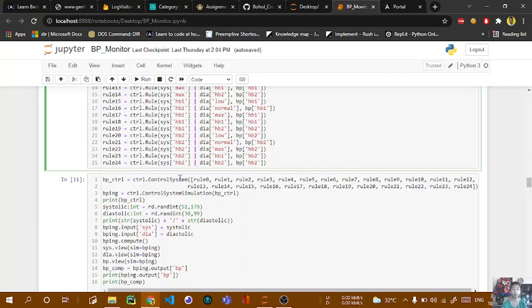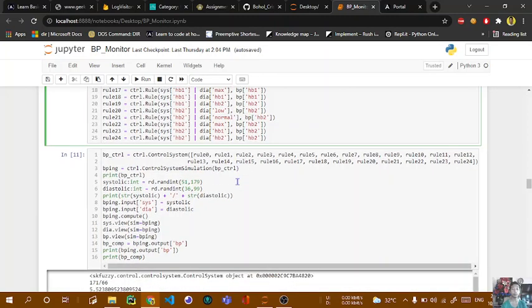For this part, we need to control the rules to read the entire rule set. So we call the control system and insert our rules, which is 25 rules. We started with 0 and the final is 24. Once we compile it, we call the control system simulation so that we can check how much the percentage of our BP is.